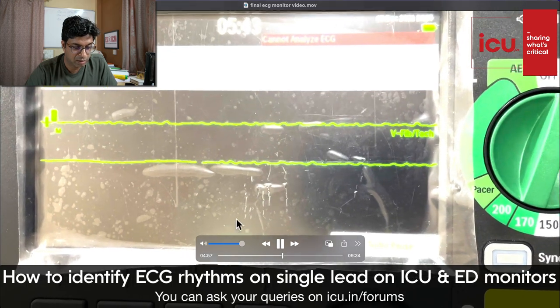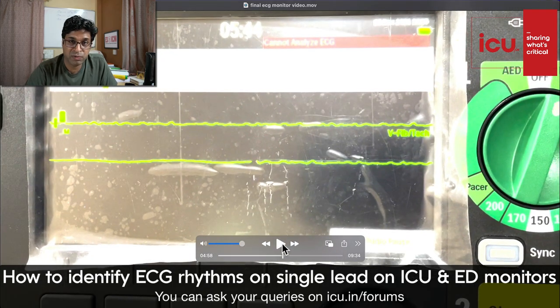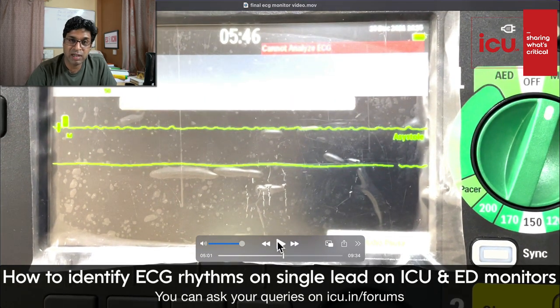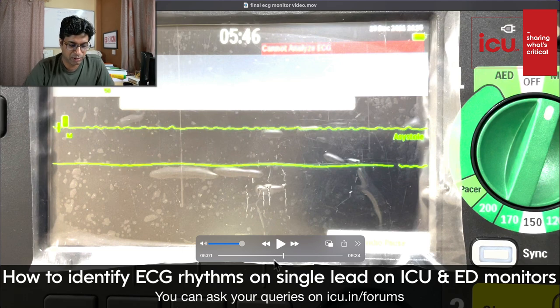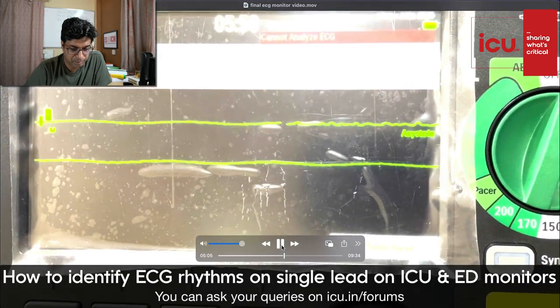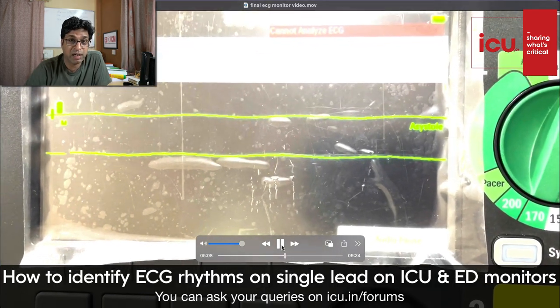Oh, we all were watching the video, we were doing nothing, and now it's a flat line. Whenever there is a flat line in your department, in the ICU, there is a protocol called the flat line protocol. In the flat line protocol, you first see the patient, then check the leads, whether there is a disruption of the leads, whether the patient is conscious. At times the patient is fine, but there is a lead disruption, because of that it could be a flat line. So there is a flat line protocol followed in every ICU. Don't forget the flat line protocol.